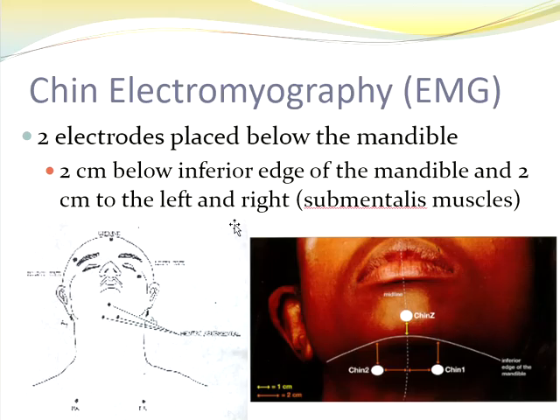However, if you do have somebody with a beard, remember we don't tape over hair. So if you do have somebody with a really thick beard, what you're going to do instead of tape is use gauze, just like how you apply the head electrodes. You're going to use gauze with a little extra paste on it to hold these electrodes in place.